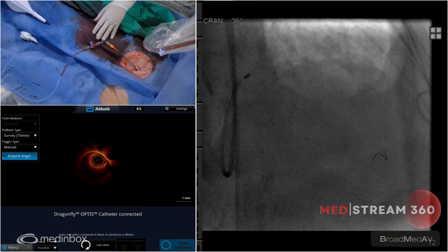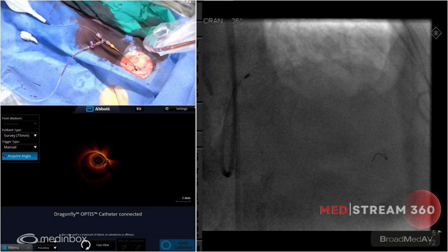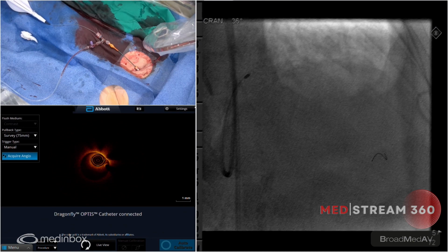That was nice. Nice polishing. What do you think about that? Should we do another one? Pretty good with that. What do you think, Arjun? It looks pretty good to me. You're through, yeah. Should we try OCT after this? Let me just lock this. Okay, you want to walk this out? Sounds good. Are you going dynaglide mode, or you don't need it? You're 7 French. I think 7 French should be okay. Sorry, let me just open this up.